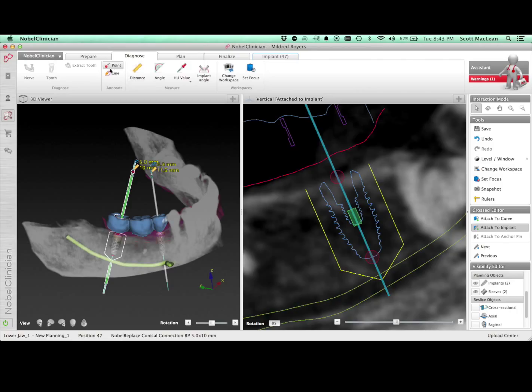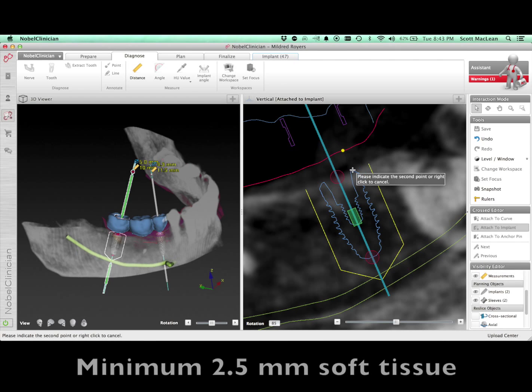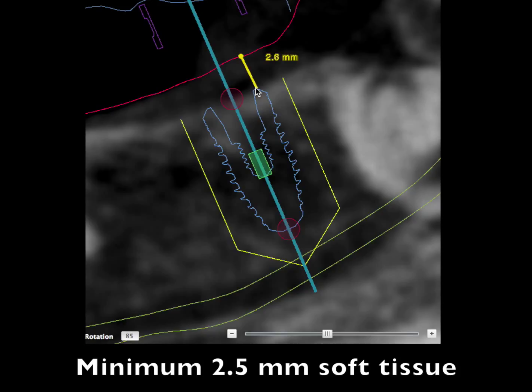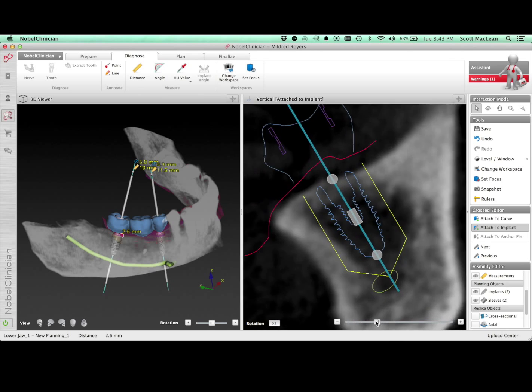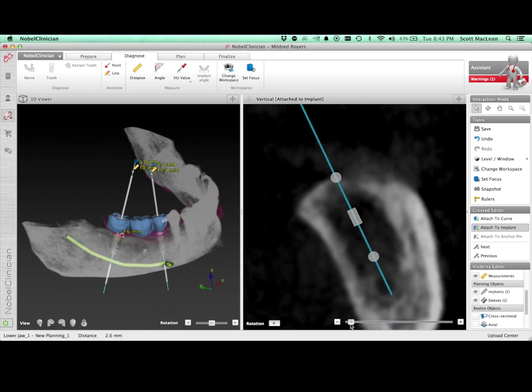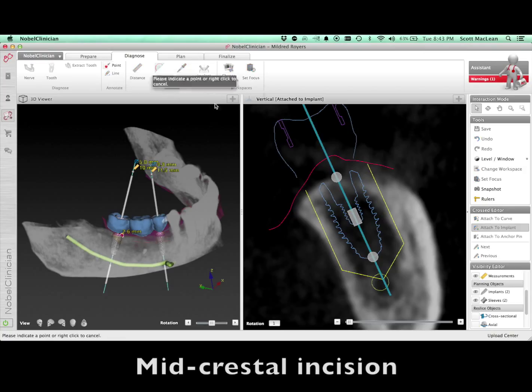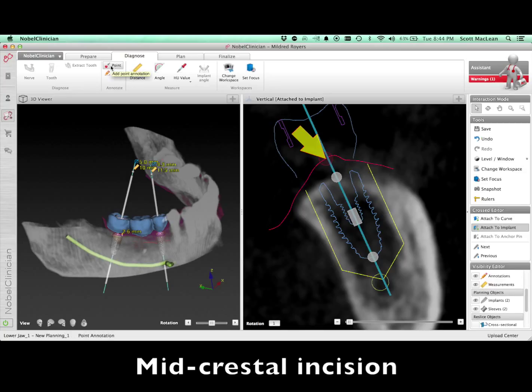I want to maintain the bone, and my flap design is going to allow me to push the tissue. I have about 2.5 millimeters of tissue here, which is adequate by research. I can also check on the mesial aspect of this particular implant — it's not bad tissue, but I still want to maintain it, so I'm not going to punch this tissue. I want to take the tissue and kind of envelope it out so I can actually maintain a thicker tissue. By making the incision right down the mid-crestal area, I'm able to take the two flaps, push them out, and get the implant into position so it's going to have a better chance of crestal bone staying and having long-term success.